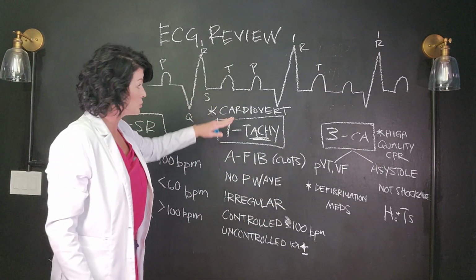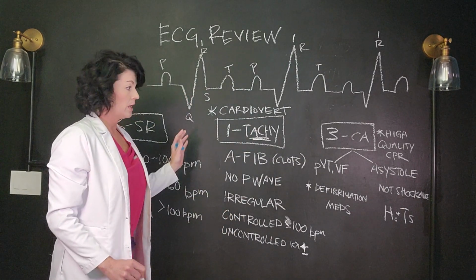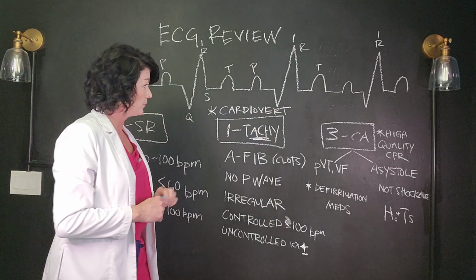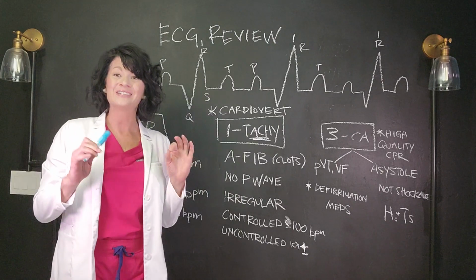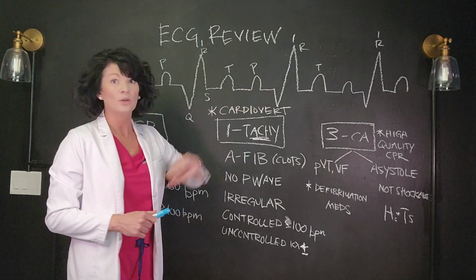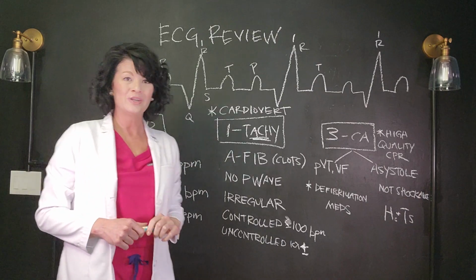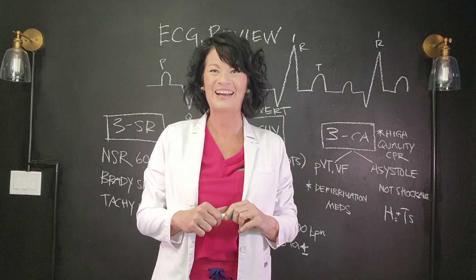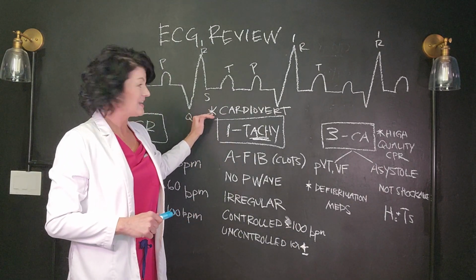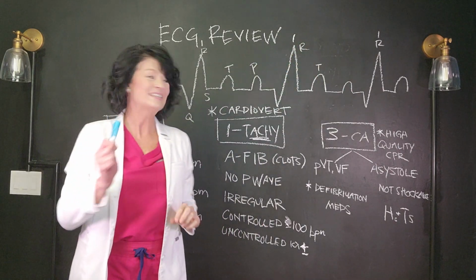Let's talk about the difference between cardioversion and defibrillation, okay? So cardioversion, and there is an excellent chart from a table from our book that compares the two. Cardioversion is we will use for tachycardic rhythms when we are going to hopefully convert it back to a normal sinus rhythm, okay? So cardioversion, we are going to give an amount of energy, and no, you do not need to know what that energy is, but we're going to give an amount of energy. Thing is that energy has to be on the R wave, okay? We call it synchronized.